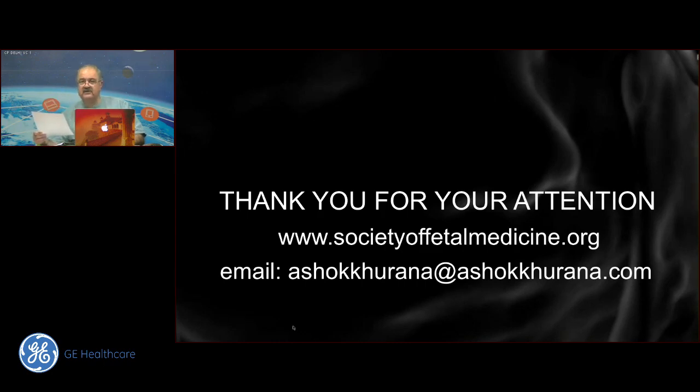What I usually use is, if I don't see a bladder filling, I always look at the genitalia and make sure that they are not ambiguous, because that's the most common association, that you will often find a very small phallus.